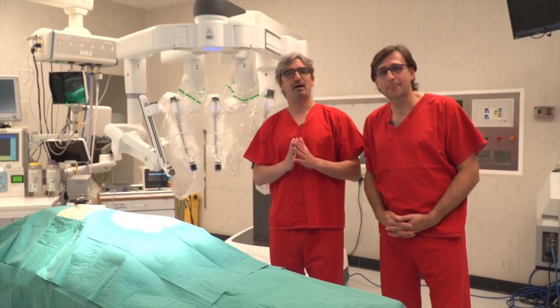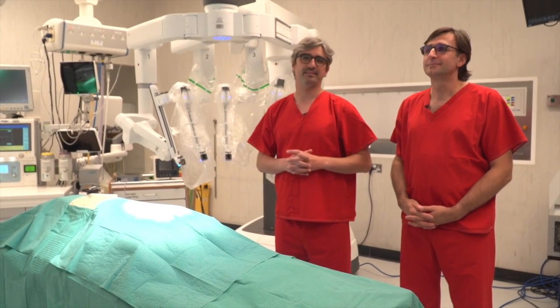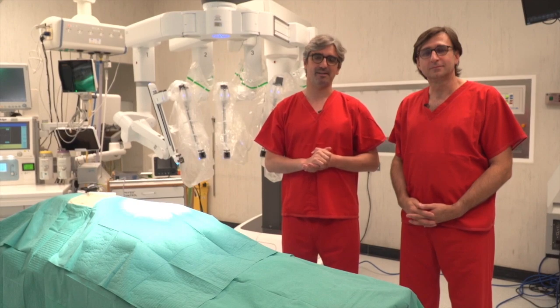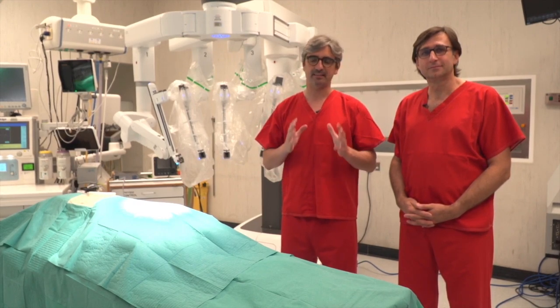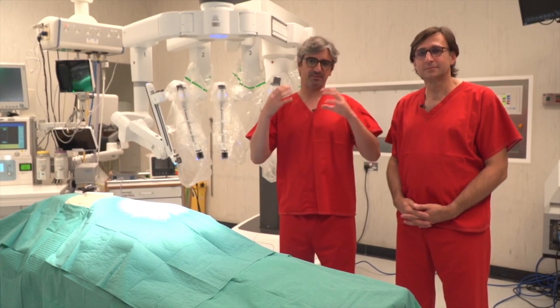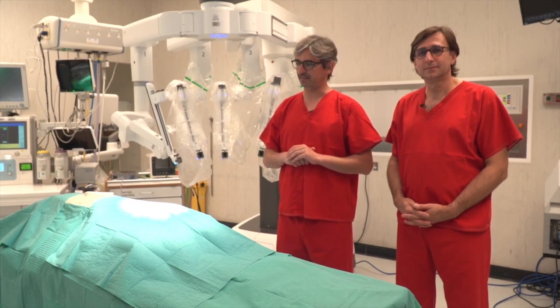We are going to show how we set up the arms, how we place the robot through a single decision. I am with Mugur Bosinciano, he is my partner in Uniportal RATS. We work together as a team — this is teamwork, 50/50. He is so important in doing this setup.